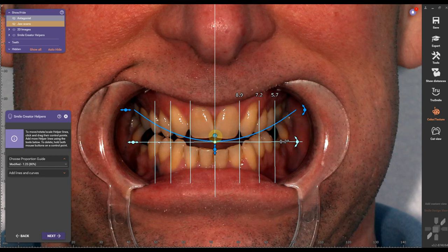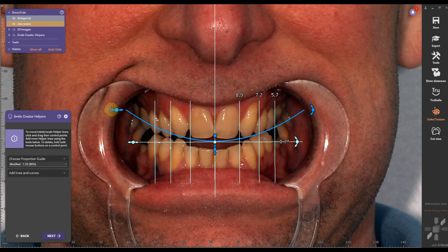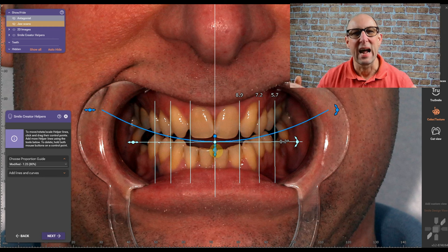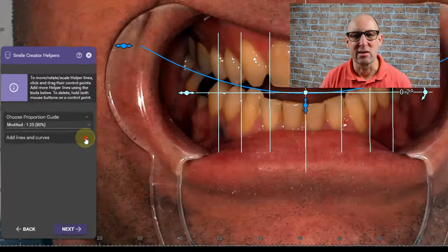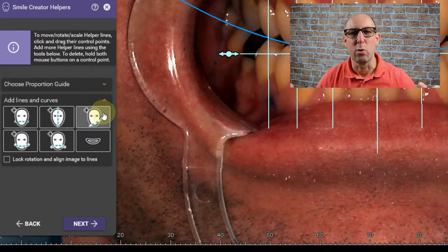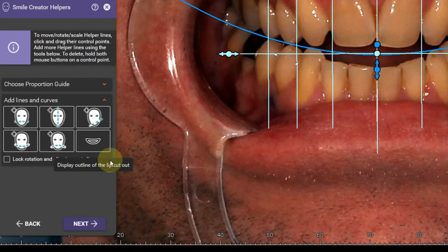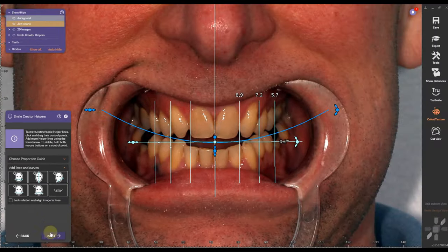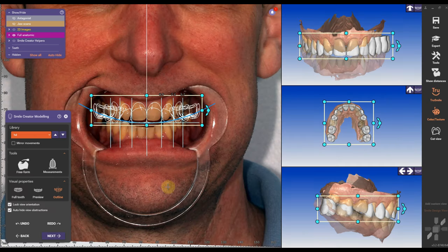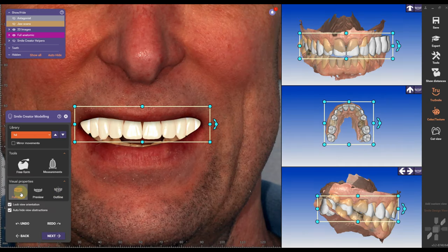Then I can orientate the smile line, which is basically a curved line where the incisal edges of the anterior teeth hit to make a nice positive curve. I can add additional horizontal or vertical lines as reference points. And then I can add a library or change libraries.